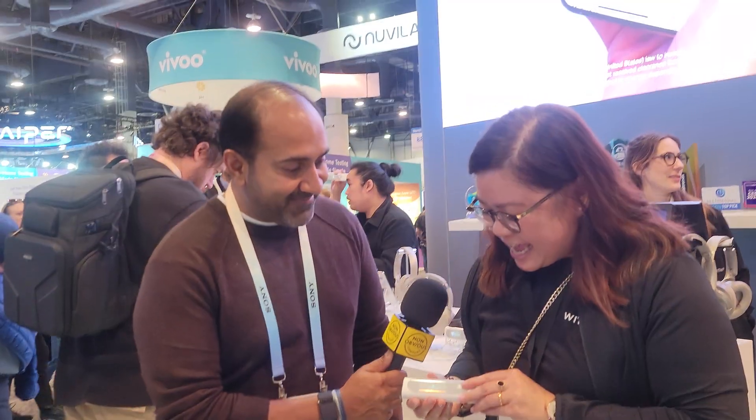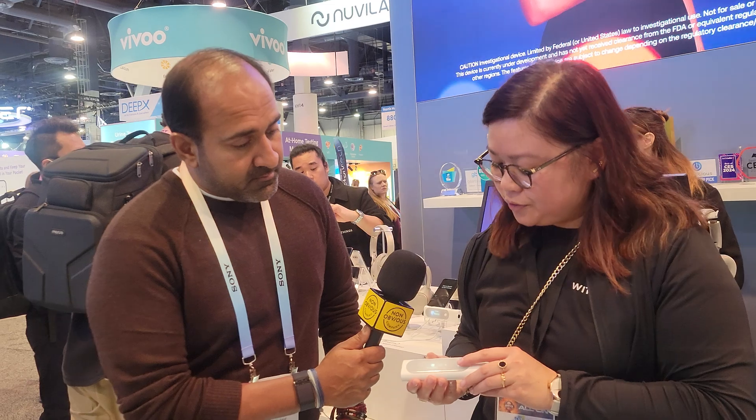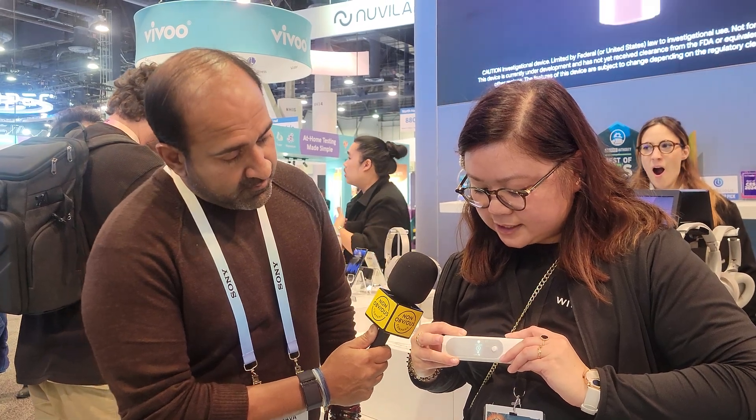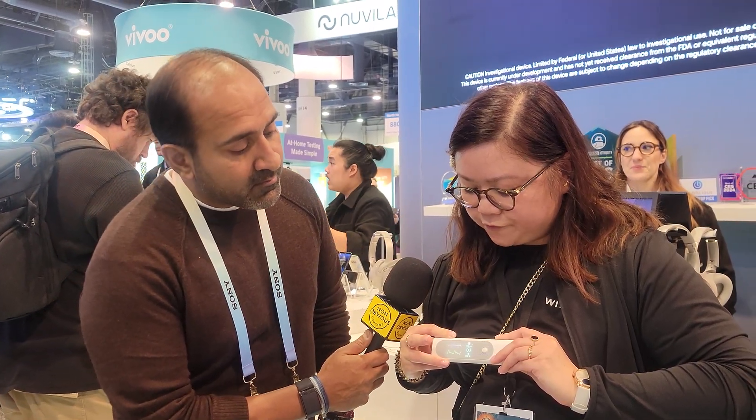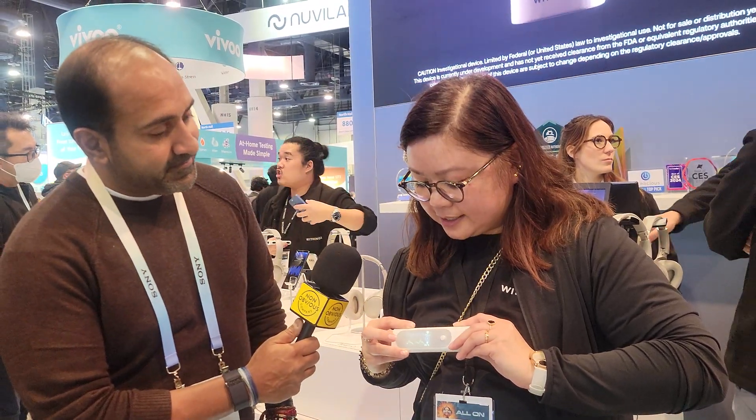The second and third measurements are ECG and SPO2, which are simultaneous through these sensors. You just put your fingers like this and you'll have the light display of the information — on top you'll have the BPM and below you'll have the SPO2 measurements. Those are very important because you can also send all the information to your doctor.